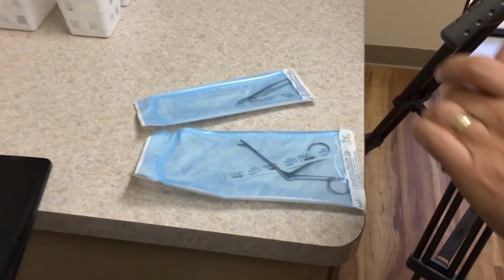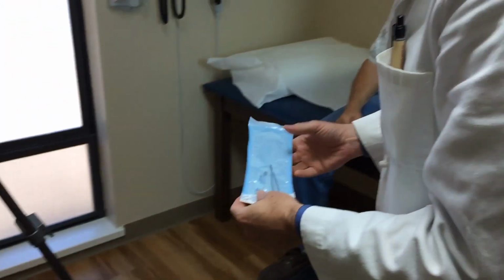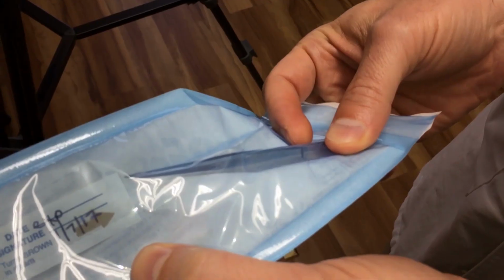Well, it has a silicone lip that should be able to grab pretty easily. We have the alligator forceps, which we used to have to keep locked up in the emergency department. And one of my favorites is these really fine tipped tweezers or forceps, and I can use the light from that. Yeah, I see. While I apprehend that, you feel it coming? Yes, I feel something there.